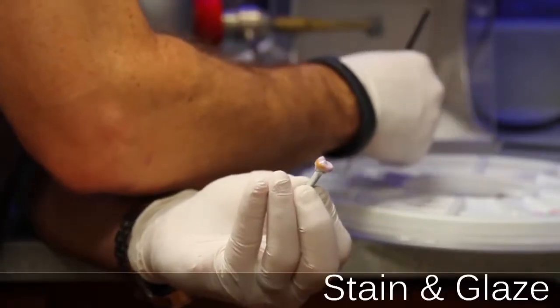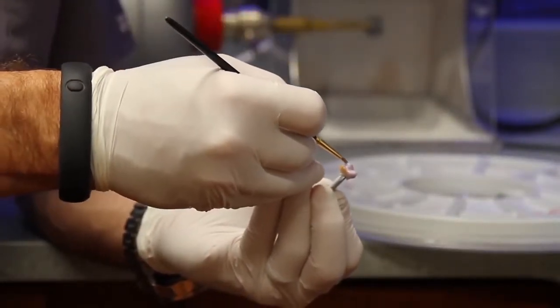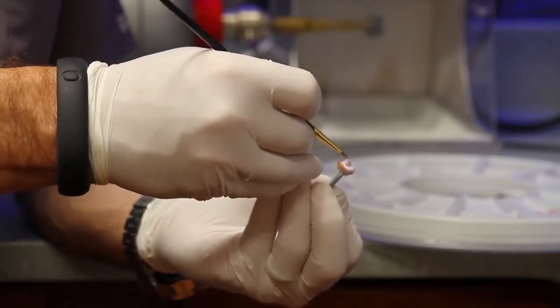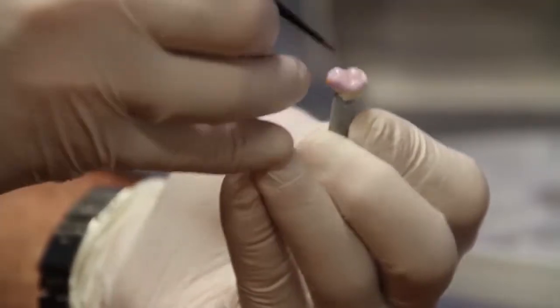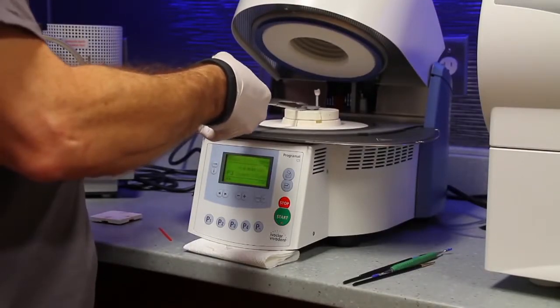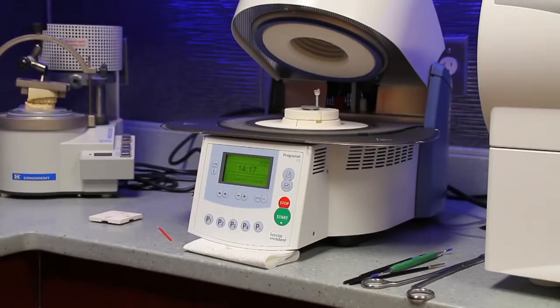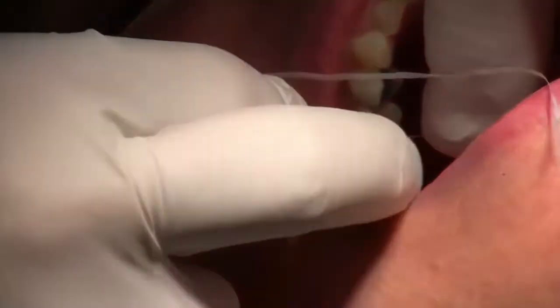After we ensure that the crown fits, the next step is to paint on a glaze and custom stain the crown according to the surrounding teeth. When finished, the crown is placed in a computerized oven and is heated under vacuum, which crystallizes the crown. The tooth will be stained permanently and the crown is strengthened. The crown is again tried in to make sure that it fits properly.